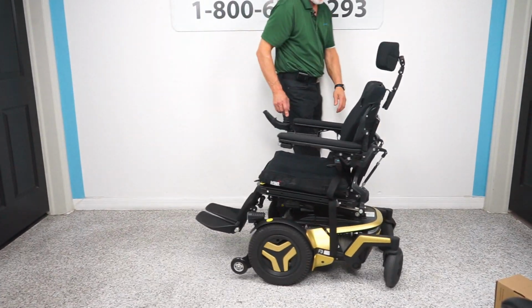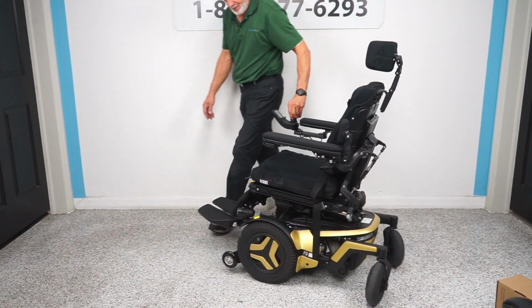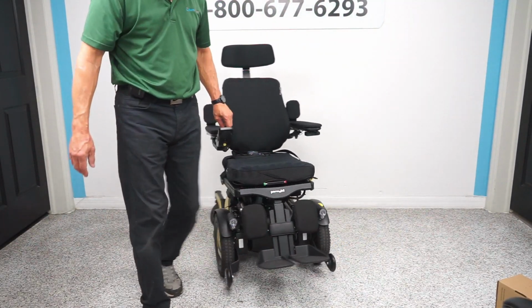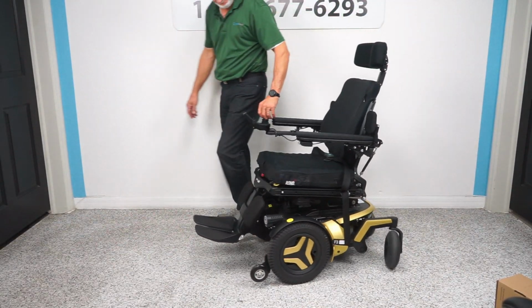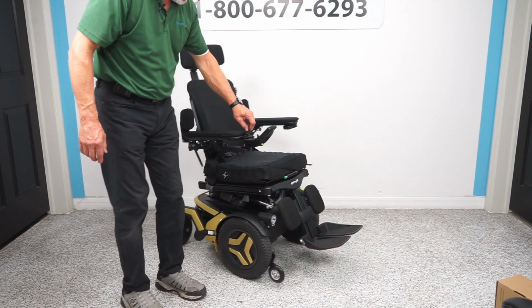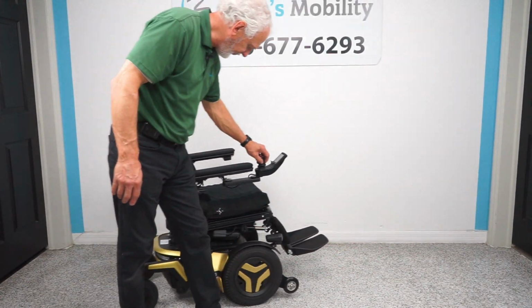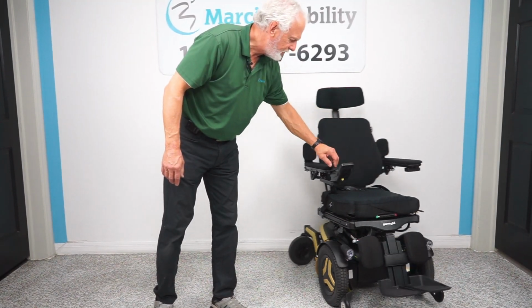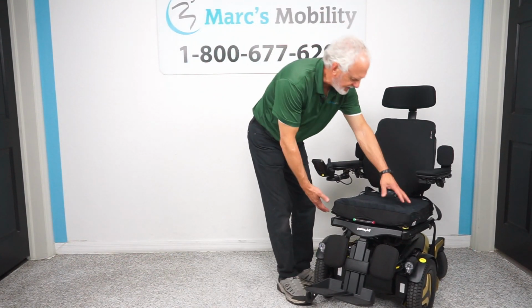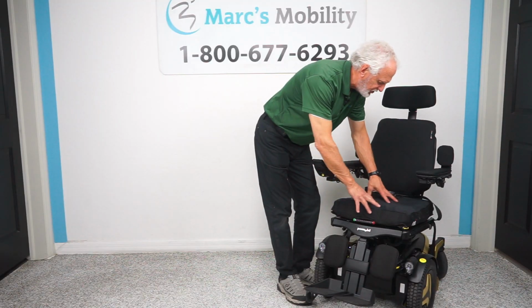So it doesn't matter what side I turn, this side, or the wheels in the back will follow the chair. See the back wheels? They rotate with the chair, okay? So if I go back, they go back. If I go forward, they'll flip back forward, okay? Now the seat on this chair is 16 by 16, but as I said, don't worry about that because we can change the seat size.